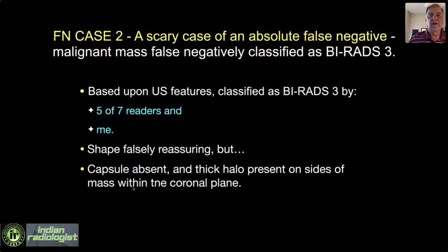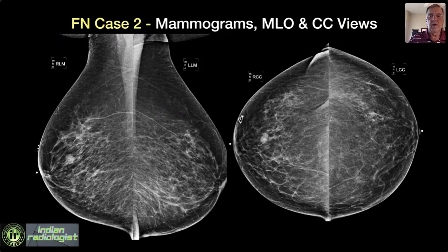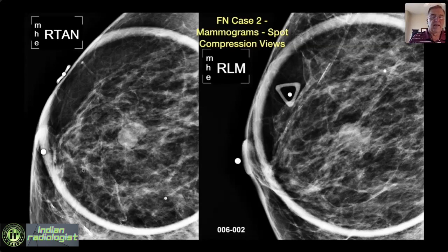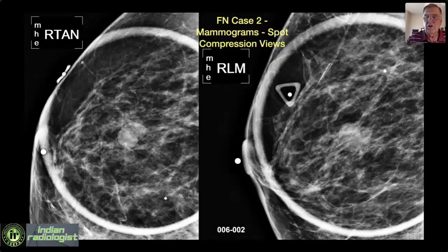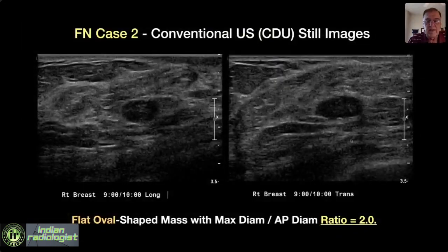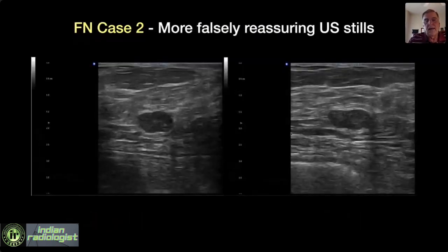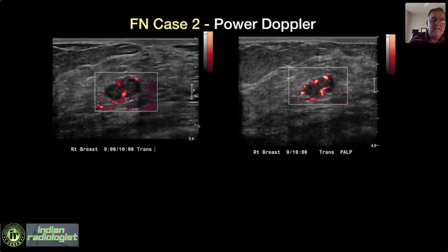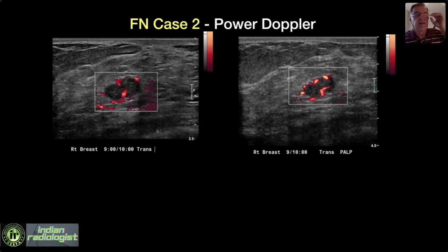Let's look at a second case focused on capsule. Here's a mammogram with a mass — on one view it's completely circumscribed, on the other it's either obscured or partially indistinct. Most people call that flat oval shape with a ratio of exactly 2:1. Video sweeps look pretty reassuring: enhanced through-transmission, oval shape. But the Doppler is positive — way more vascular than I would expect a fibroadenoma to be. This is going to be a papillary lesion or cancer. I never trust a negative Doppler, but I can certainly use a Doppler to upgrade.